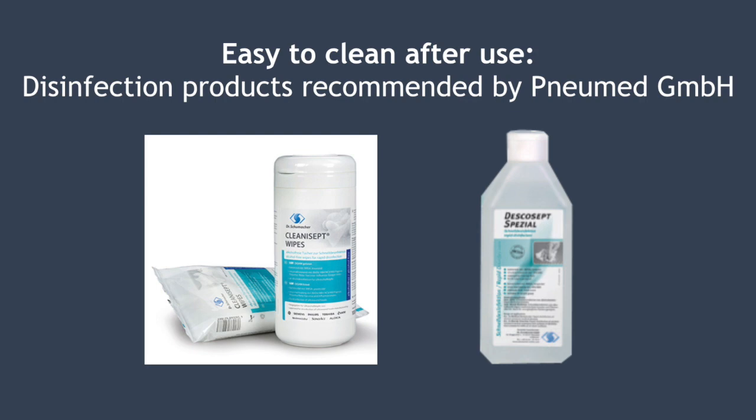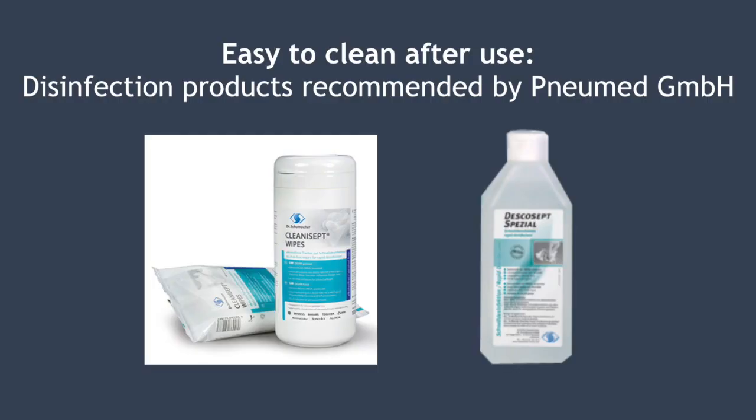We recommend that you always apply massage oil or massage cream to the skin area before treatment. In order to get this emulsion off the treatment cups again, it is best to first clean them with warm water and commercially available detergent to remove the fats. Afterwards, disinfect the cups using a disinfectant. For the acrylic glass cups, we recommend using a disinfectant without alcohol, since the alcohol attacks the acrylic glass and after a while the cups become dull and then brittle. Suitable disinfectants are available in our shop. They are available as a spray or wipes.